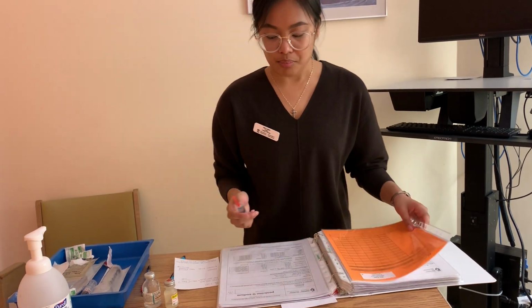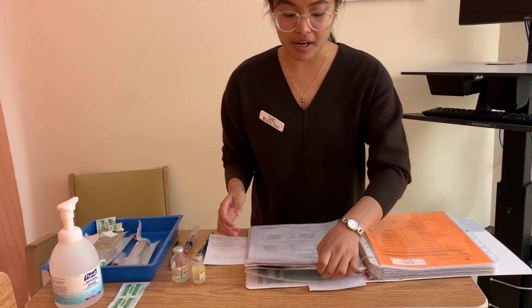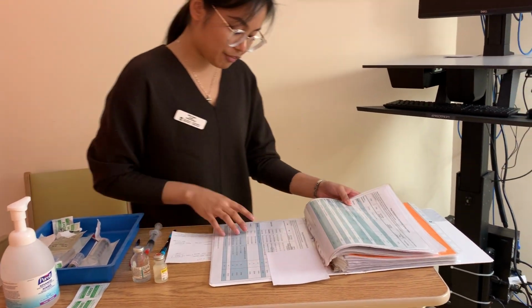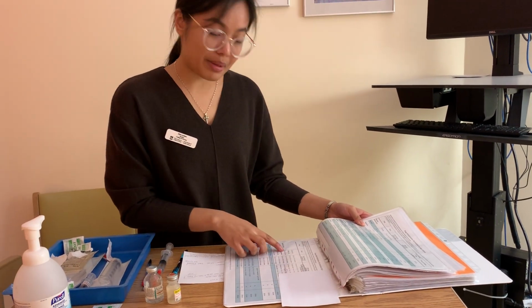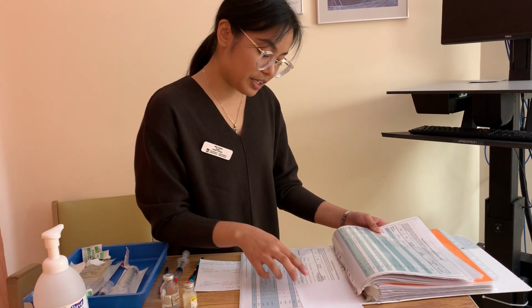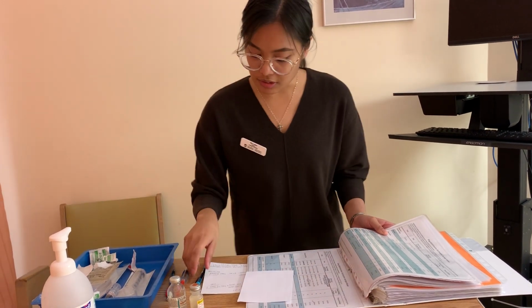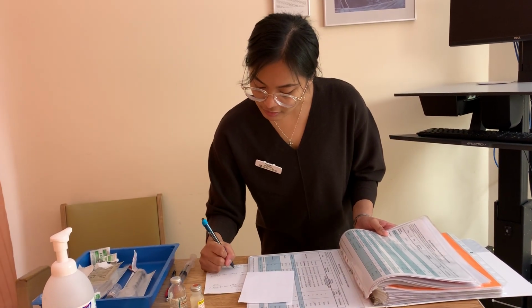Now I'm going to move on to my diluent portion. So to know that, I have to refer to my CIVA chart. So I'm going to my CIVA chart. And for Penicillin G, I know that for my order dose of 2.5 million units, I need 25 mLs in a 30 ml syringe, running at normal speed at 29 minutes. So I'm just going to write that here so I'm sure.